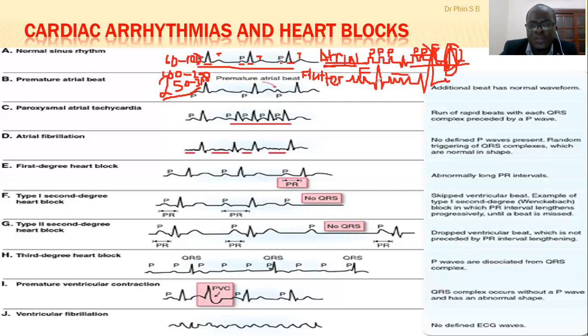These are the result of atrial flutter, meaning that the contraction of the atria has increased to between 250 and 350. Sometimes it can increase to greater than 350 contractions per minute. If it's more than that, then you have atrial fibrillation. In atrial fibrillation, when you look at the ECG, you're not going to appreciate the flutter waves.